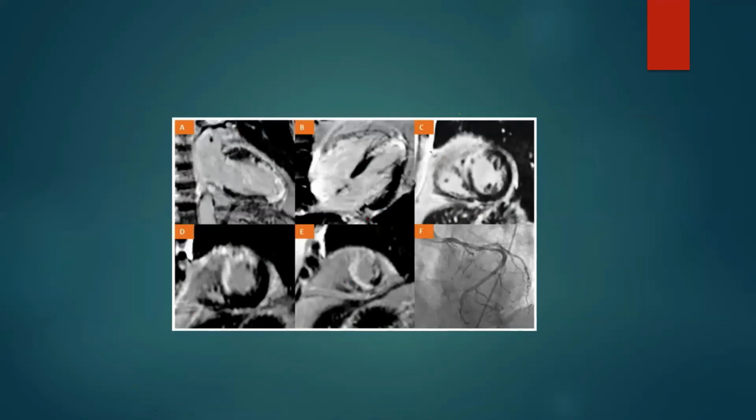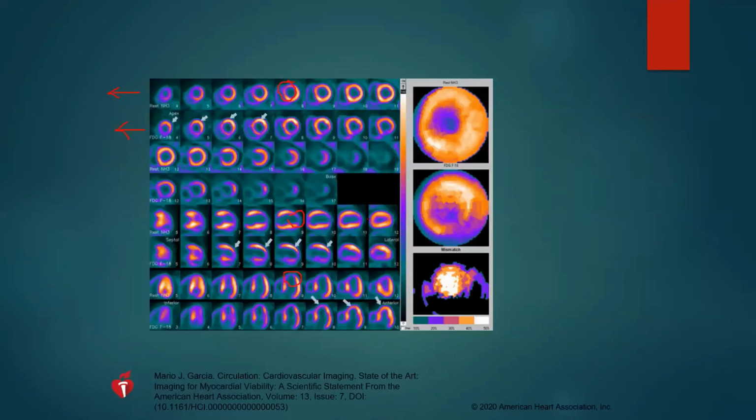And this one here is CMR, and you see that's the question. Yes, of course. How do we assess an area in percentage in nuclear? I mean, we face a lot that they mention, for example, an area more than 10% of ischemic area is, for example, an indication for revascularization. How do we measure an area affected by ischemia in nuclear studies?